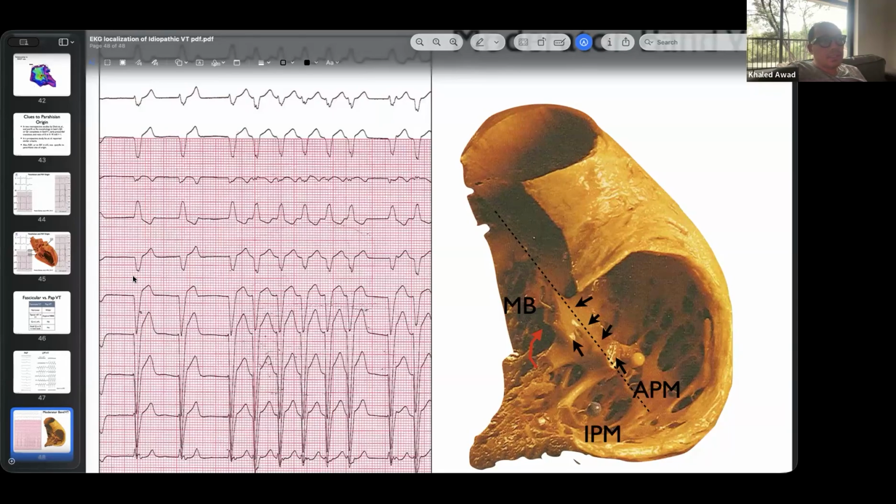I know a lot of folks who actually use an Agilis in the coronary sinus. I can tell you it really is not necessary at all. And the softer and the smaller the catheter is, and the more compliant and the less forceful, the easier it is to navigate the coronary sinus. At least in my experience, it's easier to go in with the catheter directly.